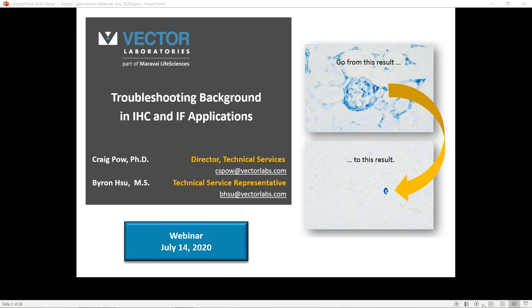Thanks very much, Byron. Hello everyone. Good morning, good afternoon, and good evening, wherever you're located globally, and thank you for joining us. I hope you find this webinar informative and certainly helpful, particularly for those of you who are currently struggling with background or frequently encounter background.